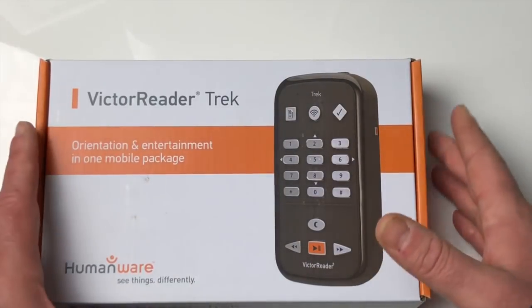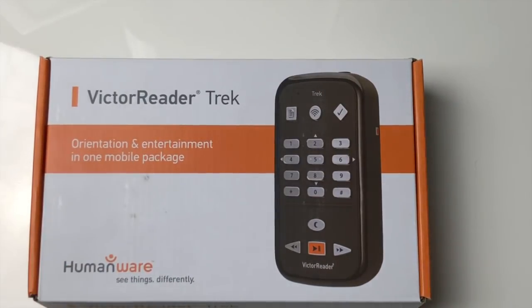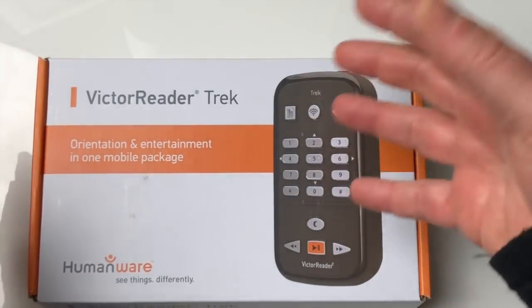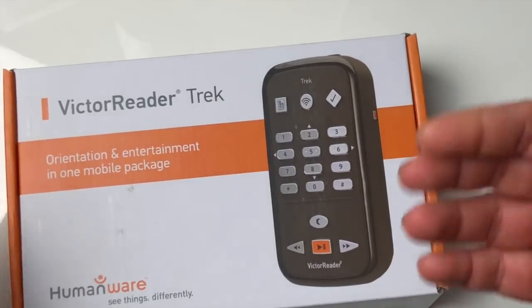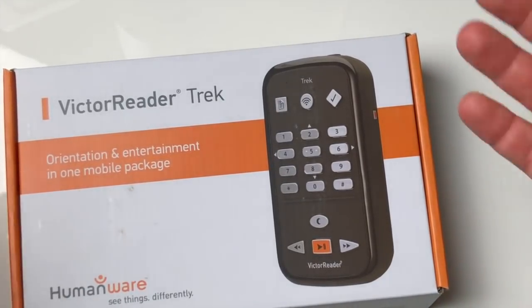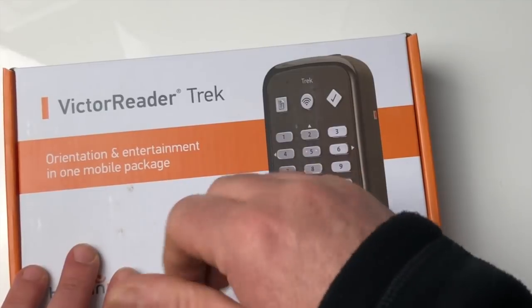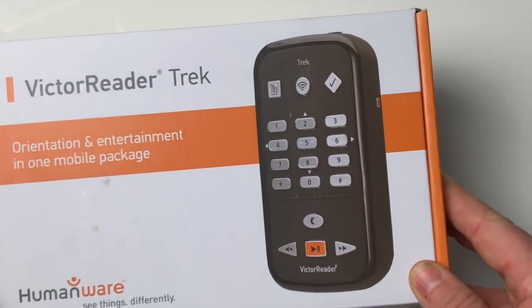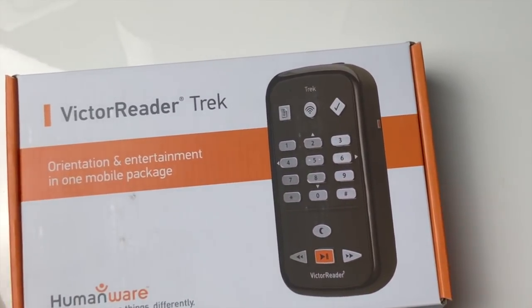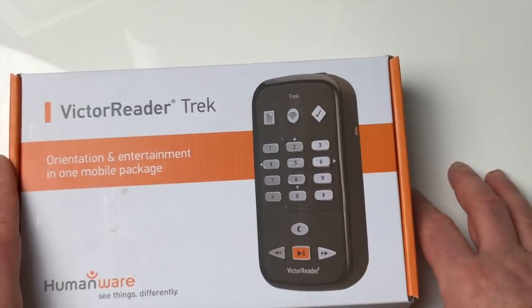Aujourd'hui on va faire ça par étapes. Je préfère vous faire le unboxing, le déballage de cette boîte. Pour les gens qui vont faire l'acquisition, ils pourront se référer à cette vidéo pour voir tous les éléments sortir de la boîte. Il y aura plusieurs vidéos sur cet appareil — on fera ensemble le premier démarrage, comment créer des routes, etc. N'hésitez pas à vous abonner à la chaîne, à liker et à partager. On rentre donc dans le déballage du nouveau Victor Reader Trek : un nouveau GPS, lecteur livre, radio.